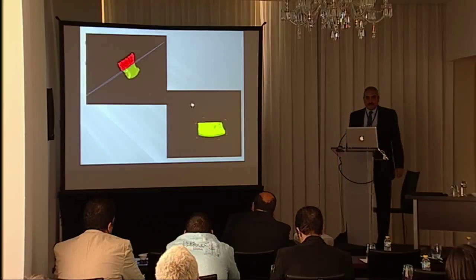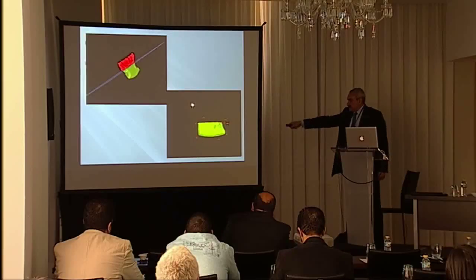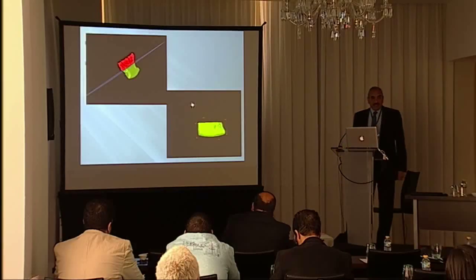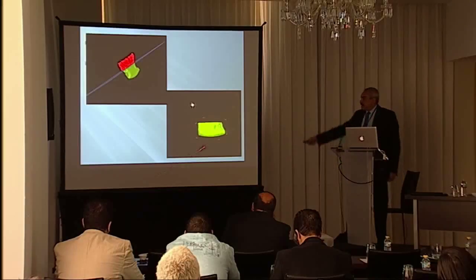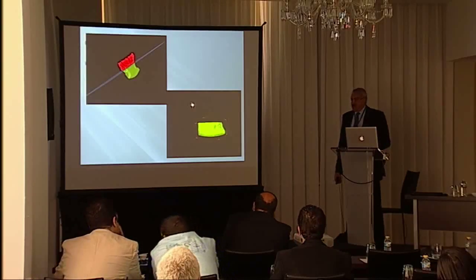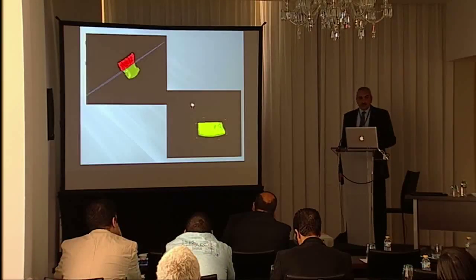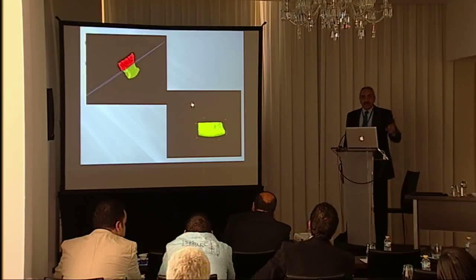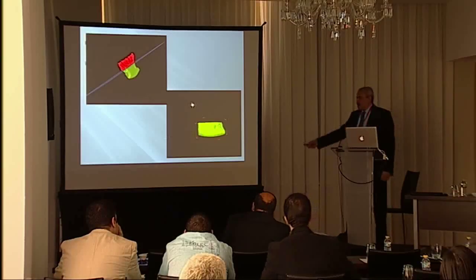Additionally, we did something that didn't work out very well. We take the teeth out, then this is the reconstruction piece, and we were making it in 3D, loading it with BMP2 and bone marrow extract in order to do the resection and place the bone substitution material. We use the SCPC, which is the silica calcium phosphate ceramics with nanopores, and we add BMP on it. We add bone marrow extract on it, so we do the resection, place this in place, and fix it with the reconstruction plate and close, and we finish the reconstruction in one go. This didn't work out very well.